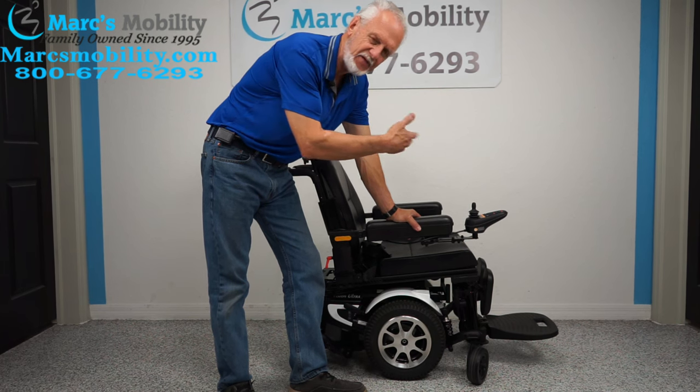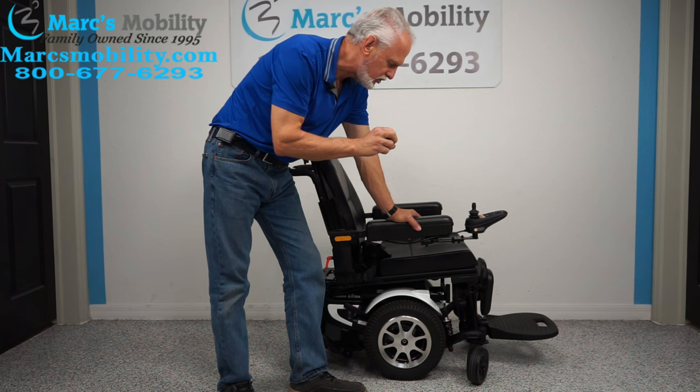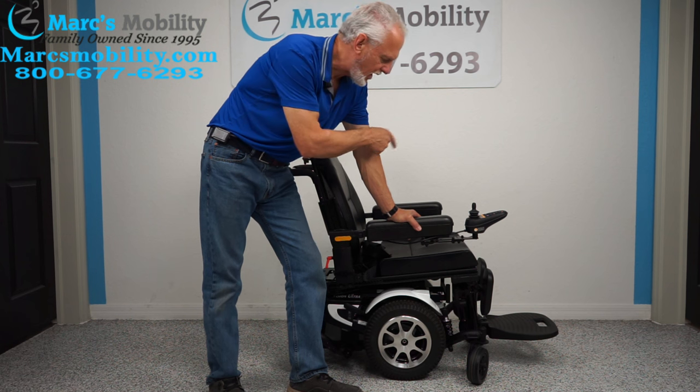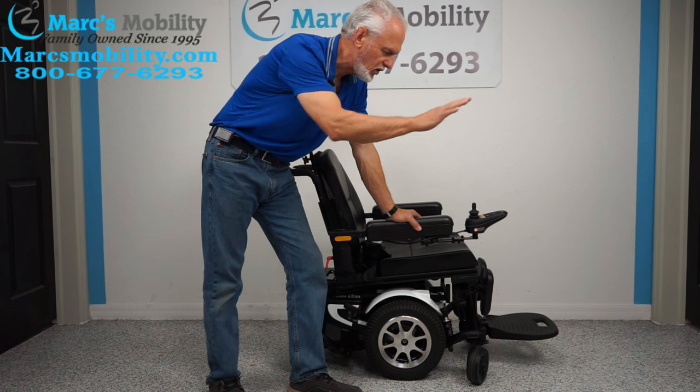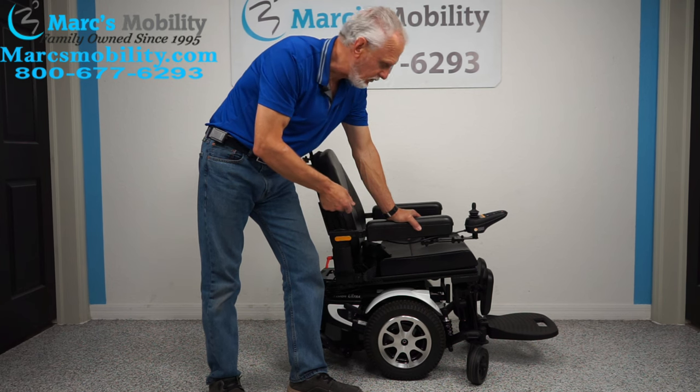Top speed is between five and six miles an hour. It has a range of about 12 miles on a battery charge. That 12 miles depends on the weight of the user — if you're going uphill, in the grass, or outside, you're not going to get 12 miles, but it should run all day long with no problem.